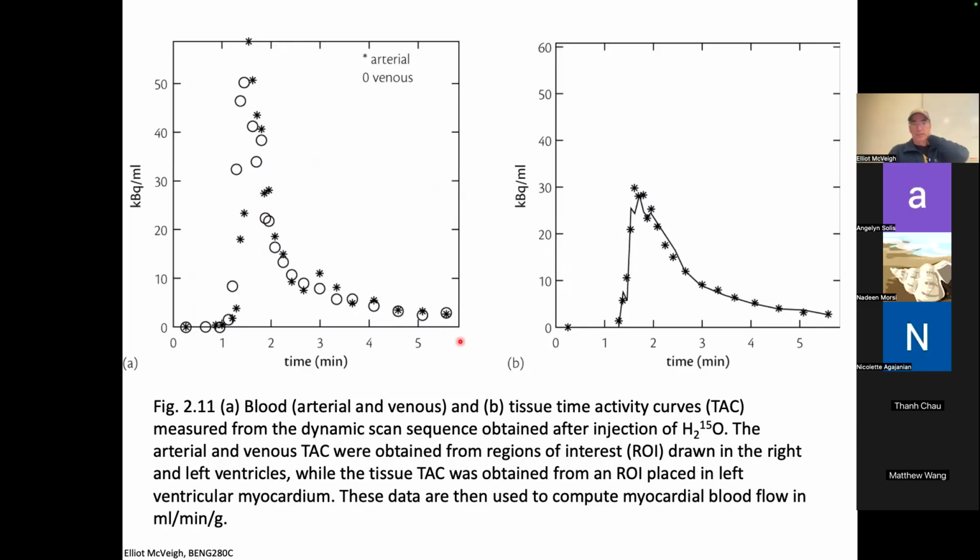Okay. Anything else about this? So what's the ideal input function, right? For one of these curves, if we want to evaluate this curve at different parts of the myocardium, the input function to the myocardium, if it went along, there's no contrast, and then boom, it went to a very large value of contrast, and then came right back down to 0.